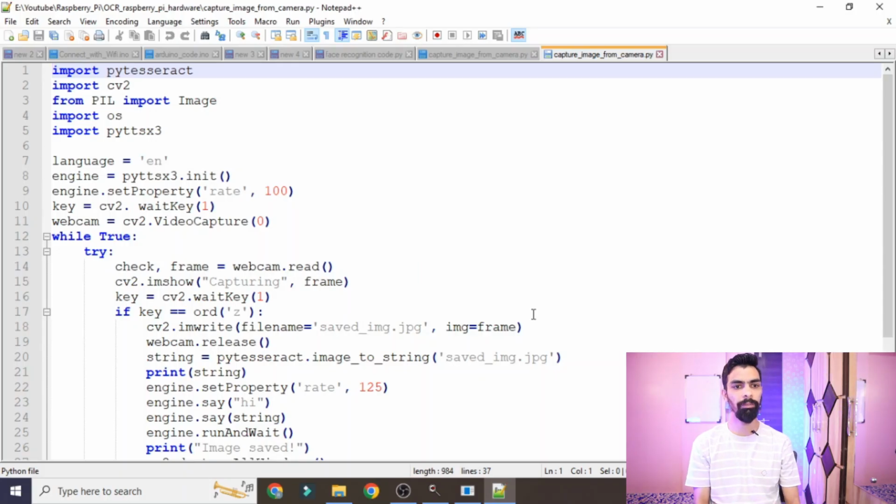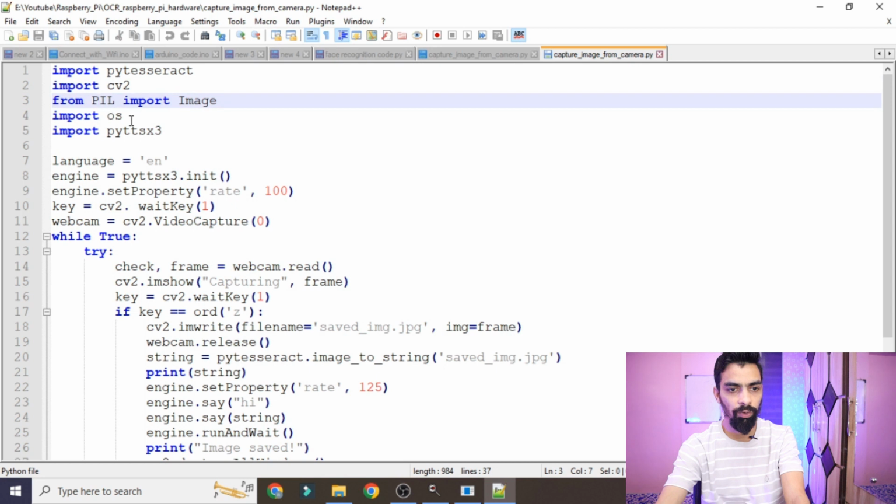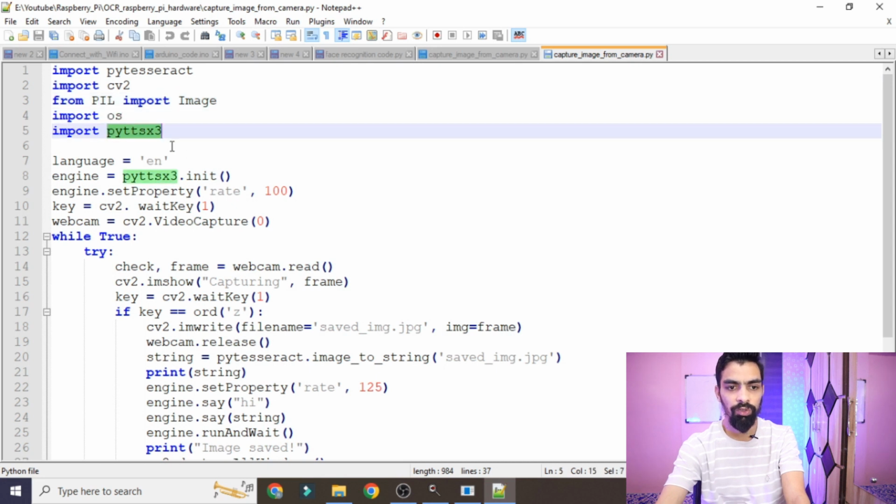Now we will see the importance of each and every line of the code. The first line is import pytesseract. This is the library which is used to convert an image into text form. Second, the cv2 library, which is used to capture the image. Then this is the PIL library, then the OS library, then we have the pyttsx3 library.